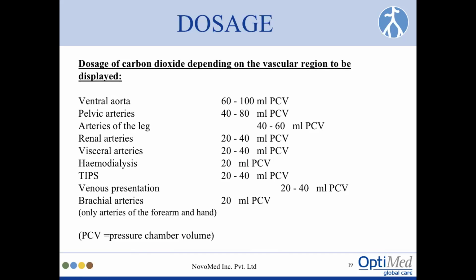And as long as your lung function is good, there is no real risk, because this really gets absorbed rapidly and gets thrown out through the lungs in one shot. So if you stagger your shoots while you study your films, you can safely put in quite a lot of carbon dioxide into the patient's system.